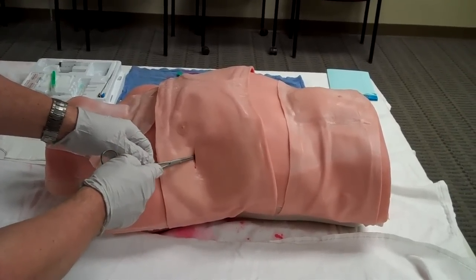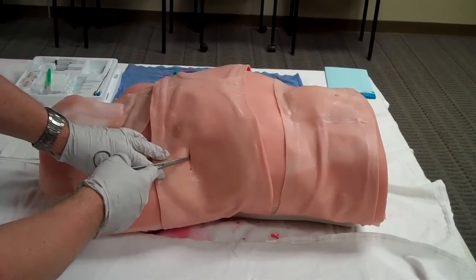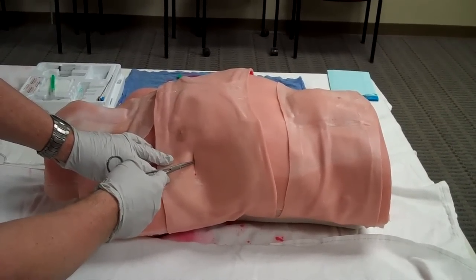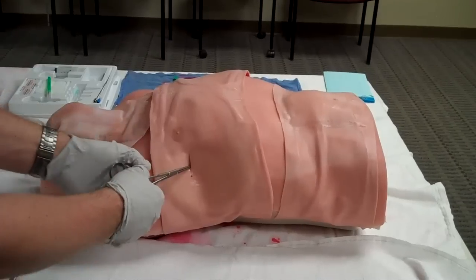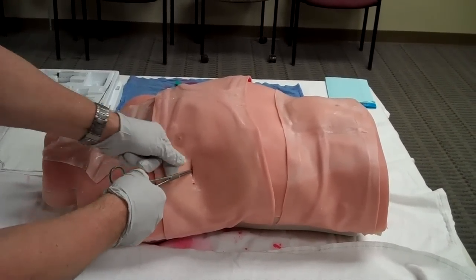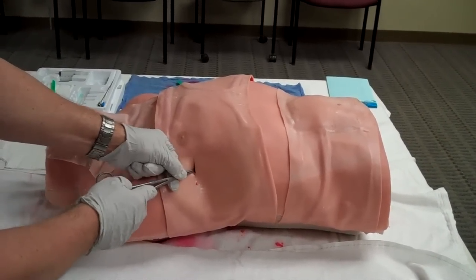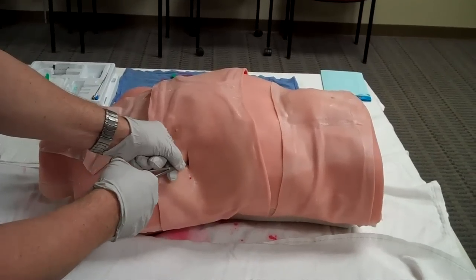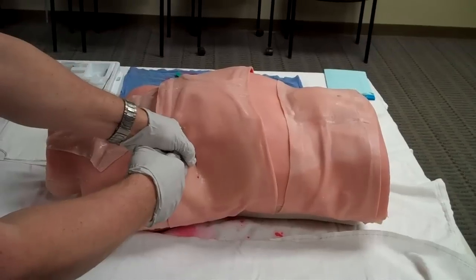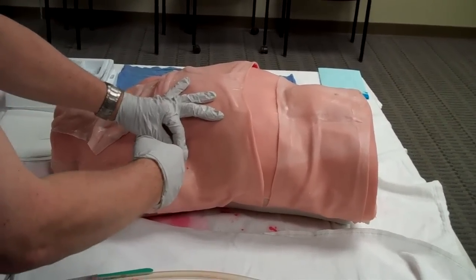And finally, you'll get deep enough where you come against the pleura. Now, when you hit the pleura, what you need to do is to puncture it, obviously, and you have to be very careful because of what can happen when you puncture it. If you're just holding like this, you can push in all the way, and that's not a very good idea. So what I prefer to do is I put my fingers here on the clamp, and I push in until my fingers stop against the chest wall, and you'll generally hear a pop, and you can hear it right there.